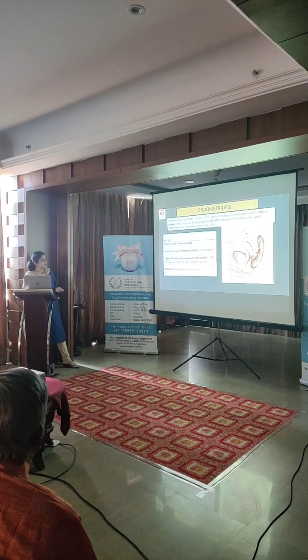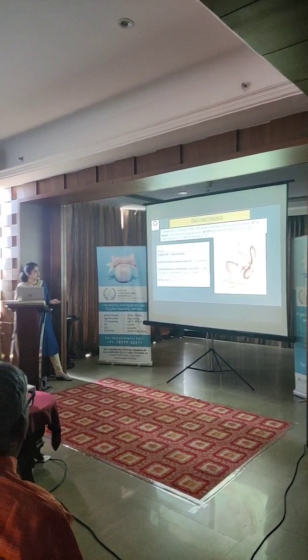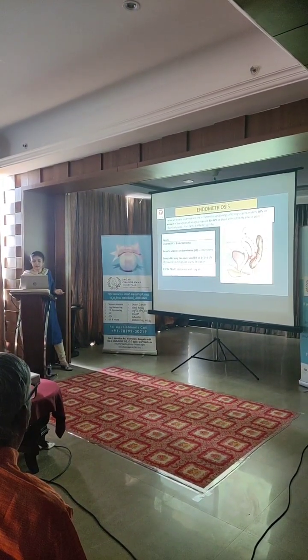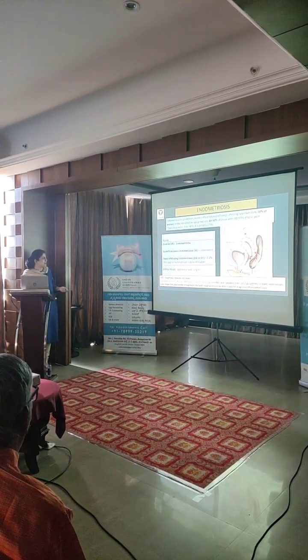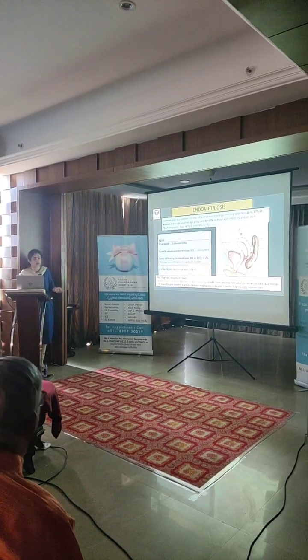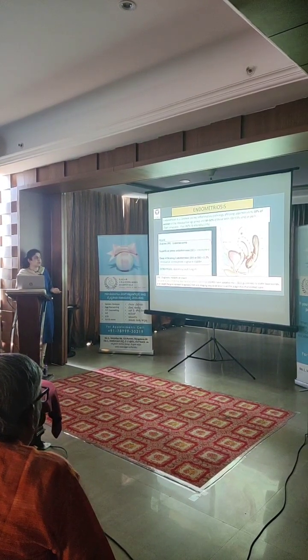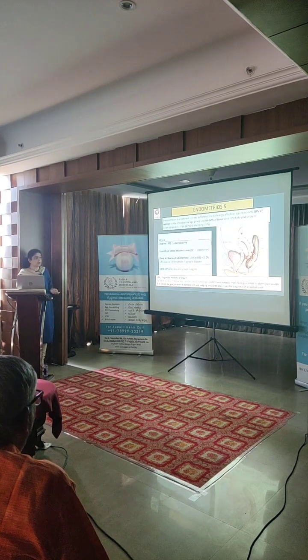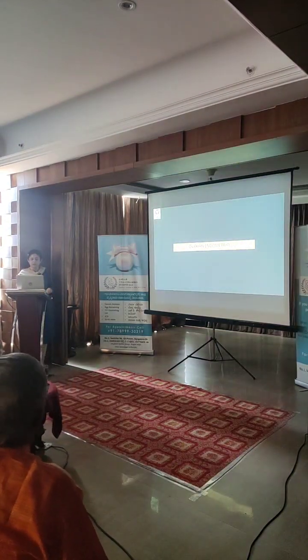endometriosis. Now, endometriosis, like I told you, superficial endometriosis is commonest and most difficult to pick up. But yet, I'm totally in love with ultrasound, as you might know. Ultrasound is the diagnostic modality of choice to pick up displaced endometrium, including endometriosis. And ESHRE in their 2022 guidelines have said that imaging is the gold standard now and not laparoscopy, because you cannot see below adhesions what's happening on laparoscopy. So let's start off with ovarian endometriosis.